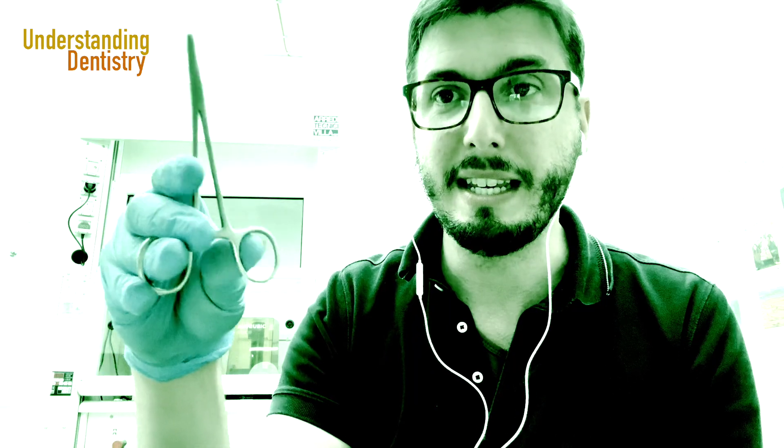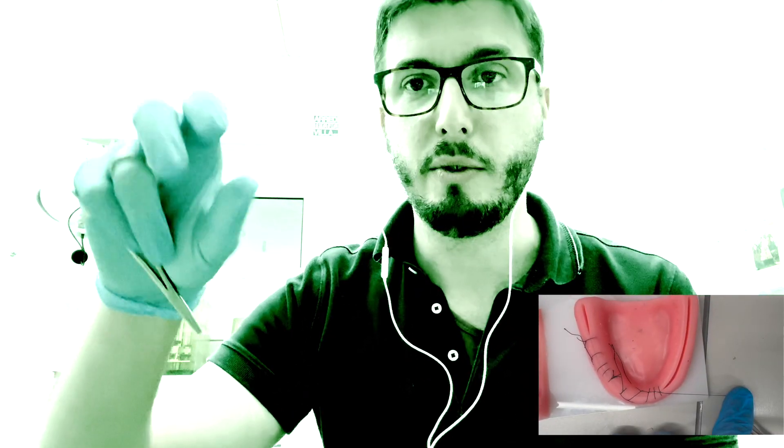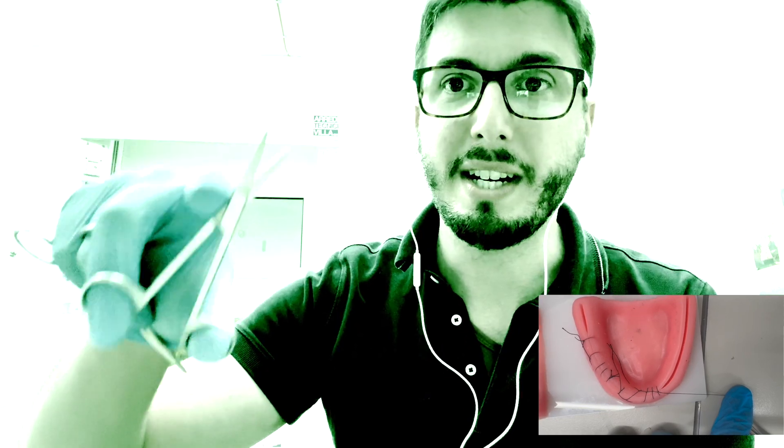Now that you are holding like this, if you need you can always rotate your needle holder and you still have three fingers available. You can, for example, hold the scissors to cut the suture during the procedure. If you are working by yourself without a dental assistant, you can use this and then come back to the original position. I'm using silk 4-0 sutures, but you can use nylon and even resorbable sutures depending on the clinical situation.